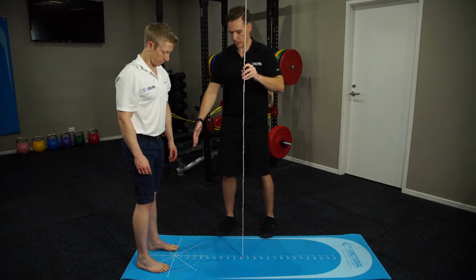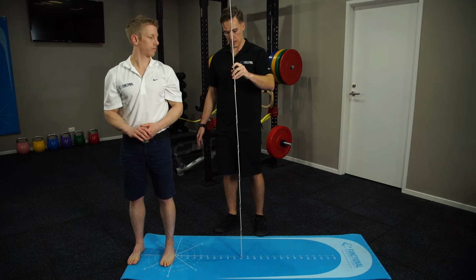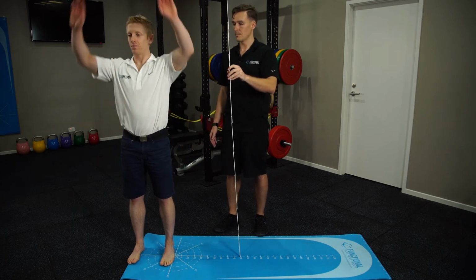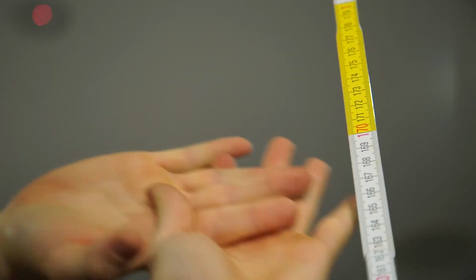So we'll get Stephen now to stand with his left foot, just the lateral aspect, once again, near the 90-degree line. And then we'll get Stephen to stand with his arms above his head. And I'll get you now, Stephen, to reach across towards our measurement pole. And once again, we can increase the distance and check how far is Stephen able to reach.